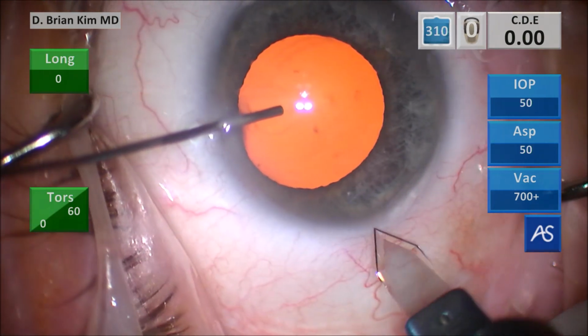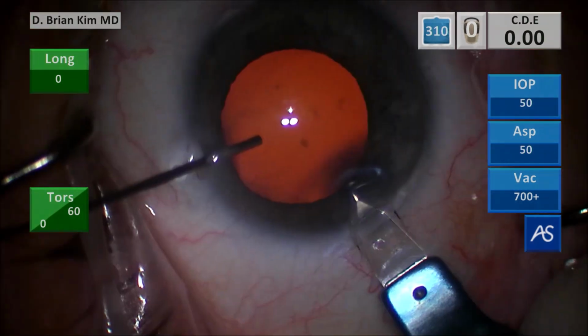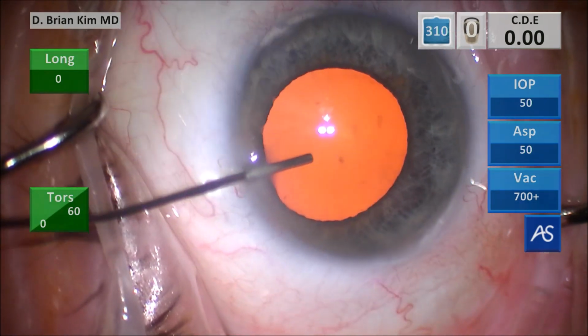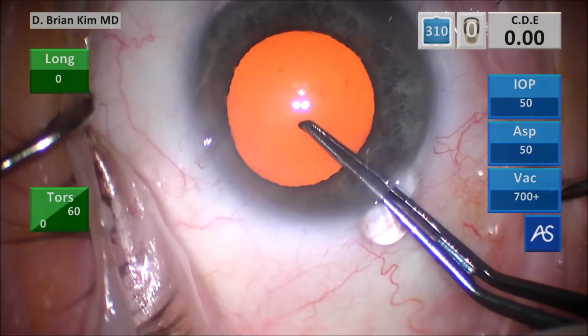This is the triplanar corneal incision. I make a vertical groove, place the blade into the deep part of the groove, and tunnel through the cornea. Using the cannula to control the eye, I'm able to enter it with a triplanar incision. I inject some more viscoelastic to flatten the anterior capsule, and this is the puncture style rhexis.